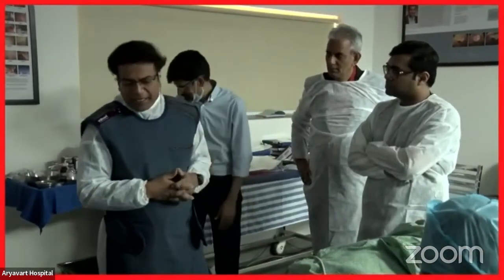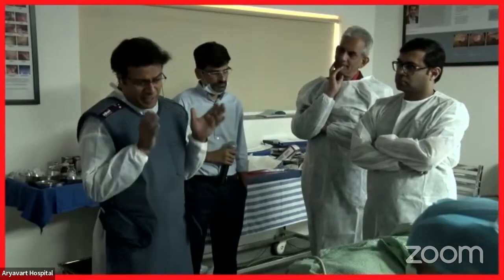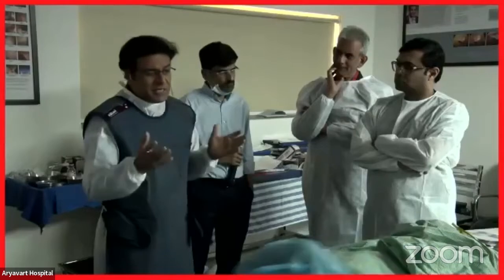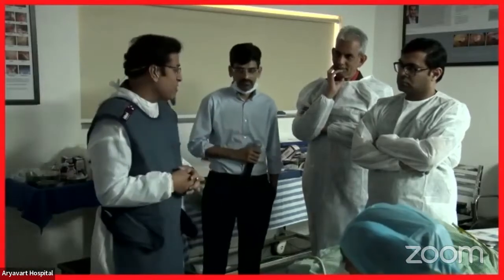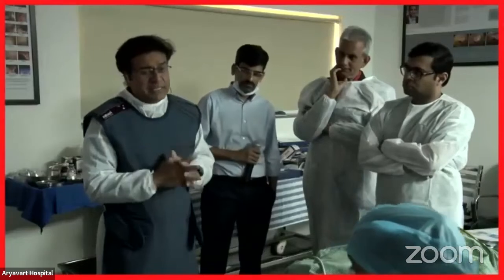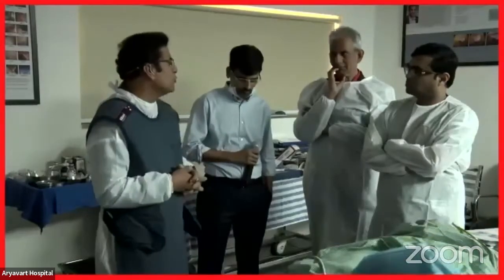So I think the double balloon is important for two reasons. What you want to avoid in EUS is that when you instill fluid, the fluid goes off because of peristalsis, so you don't get a distended structure, similar to a pseudocyst. That is the problem you want to fix, and the double balloon is the way. And second, you want to be certain that the segment you are puncturing is small bowel and not colon.